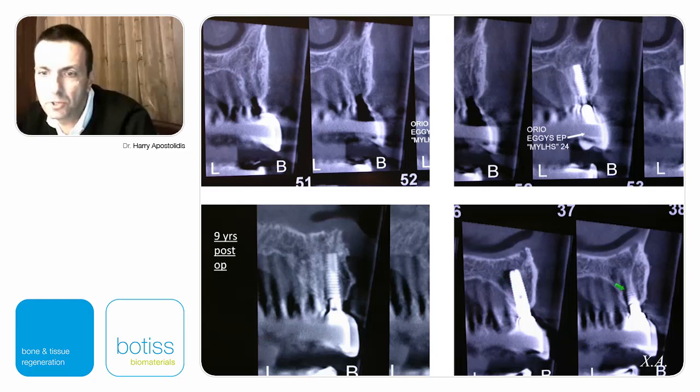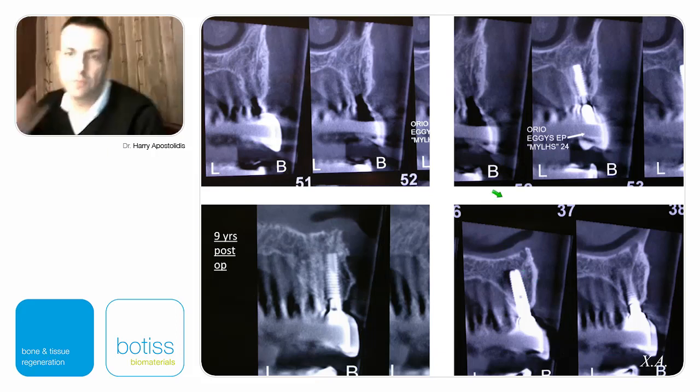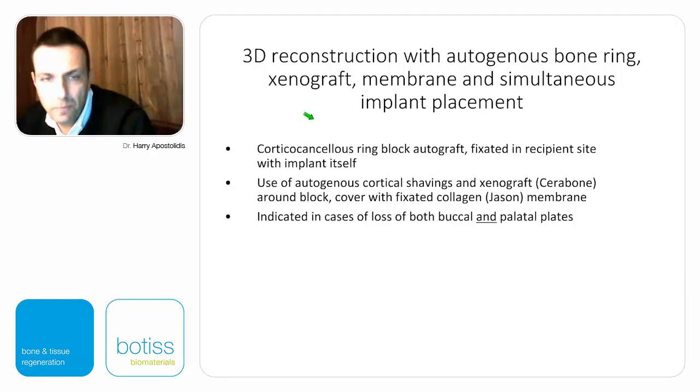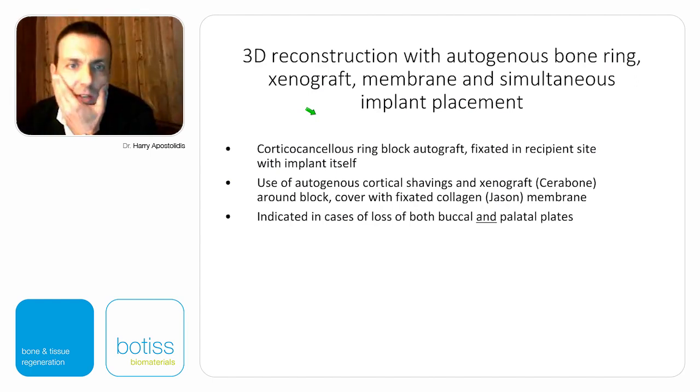Look at the perfect position of the implants. I mean, no resorption. So autogenous blocks, if worked correctly, they do work. Let's just mention another nice technique that I've been using lately.